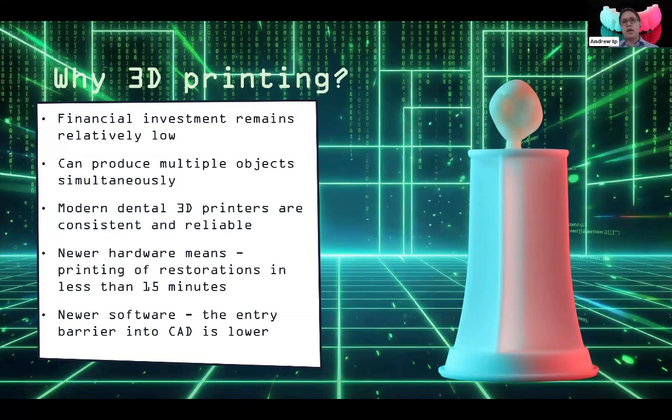As our technologies have improved, it's funny. When I first started 3D printing definitive restorations about 5 years ago, we would 3D print crowns in about 25 to 35 minutes. Nowadays, we can print the same file in a stronger material in less than 8 minutes in many situations.